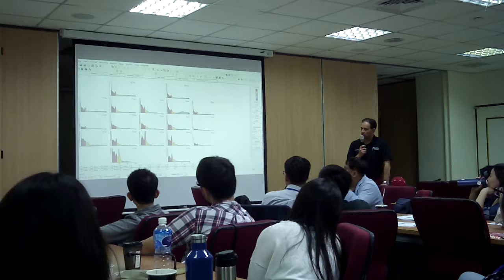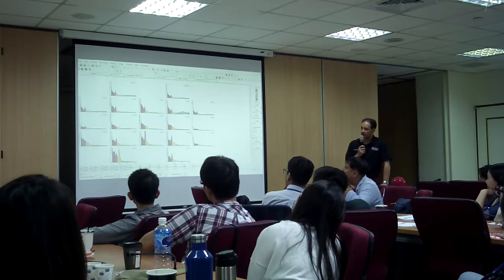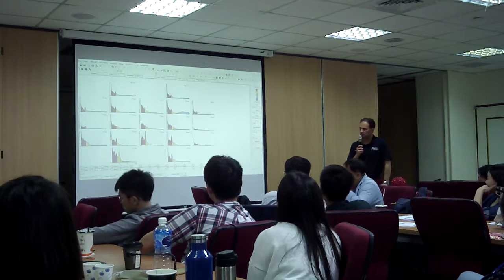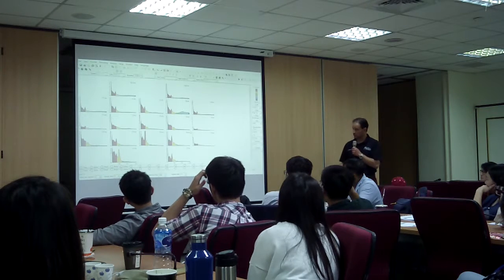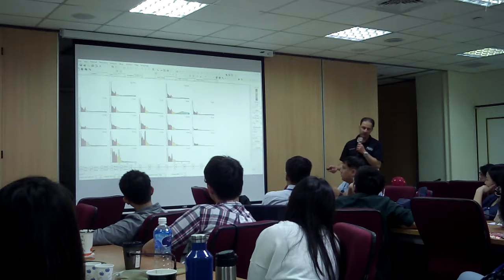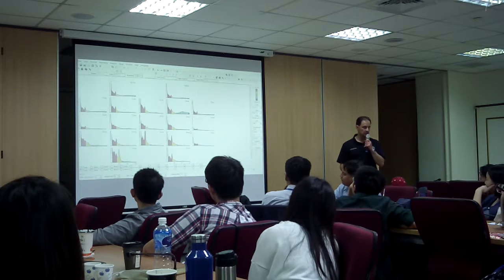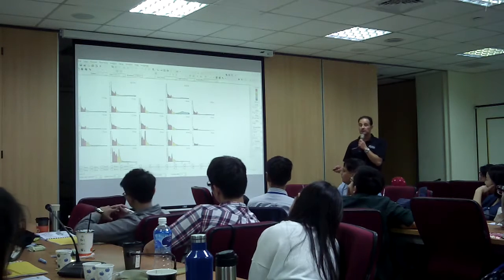Okay. And we're going to suppress. What are you going to suppress? You don't have to tell me the range. Just tell me the name of the brain waves. So which one is? Theta. So this one is delta. This one is theta. This one is. So we're going to suppress whatever it is in that range, and we're going to reward. Are you going to reward something? Yes. What is it? 12 to 15. There you go. So is that clear?